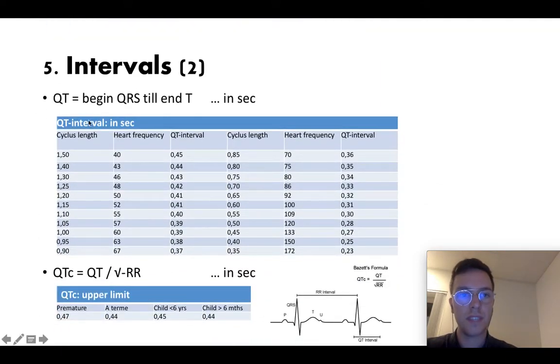Then check QT which is the beginning of QRS till the end of T and note that in seconds. Again I noted the normal values. And check QTc which is QT divided by the square root of RR, and RR interval is the tip of the QRS till the next tip of the QRS. The normal time for example for a child younger than six years would be 0.45 seconds.